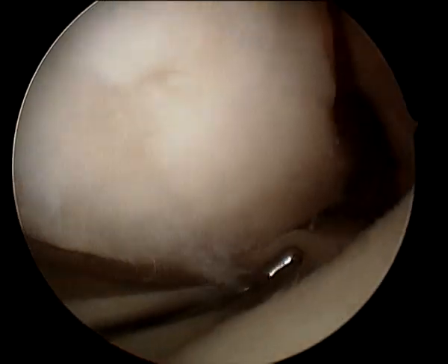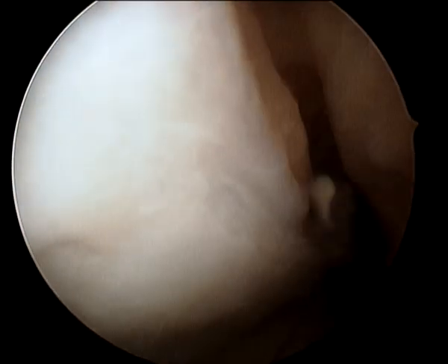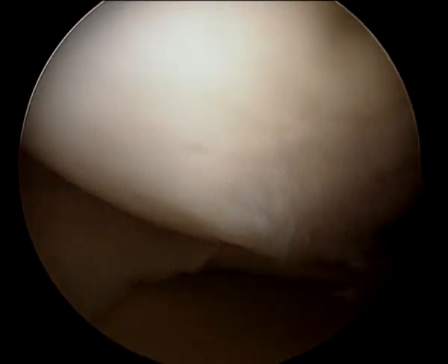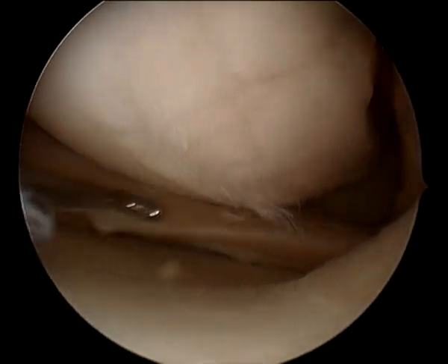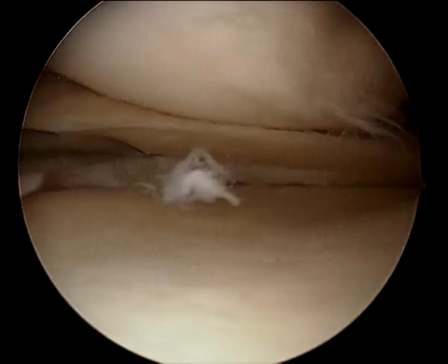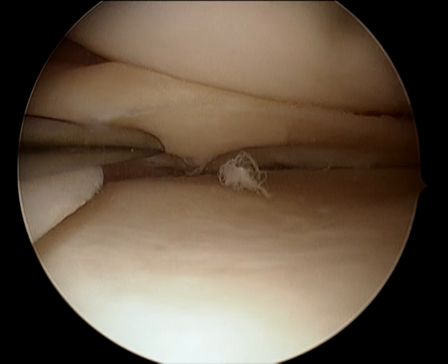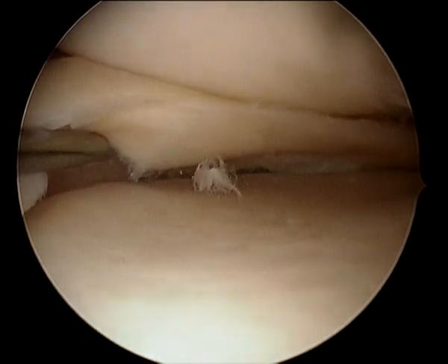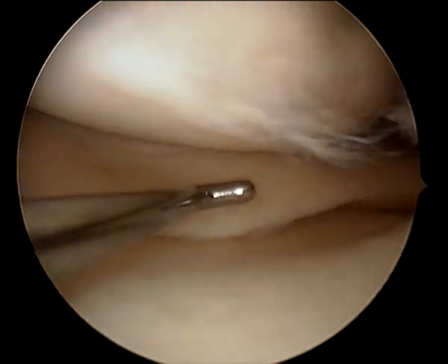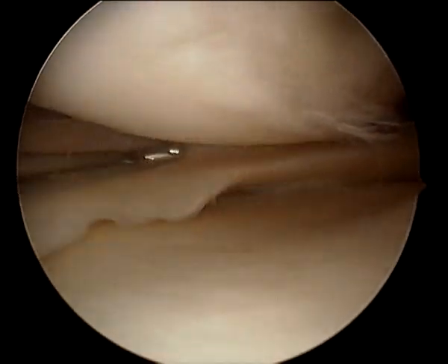The main problem is a torn shock absorber, and I'll just show you that. The shock absorber tear is there — you can see it goes from there, underneath, it's torn there. I've just got underneath the tear. So it's quite a big tear; it goes from there to there. So we're going to remove that for you.